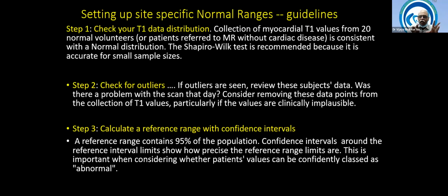So always in normal reference ranges, you've got external validation, an external reference range of the same conditions. It is a very easy thing. Just follow it. Remember what I have told you. All conditions must be the same. In 20, if it is 2, it's okay. Again, if more than 3 are coming outside your normal range, do the study entirely again.